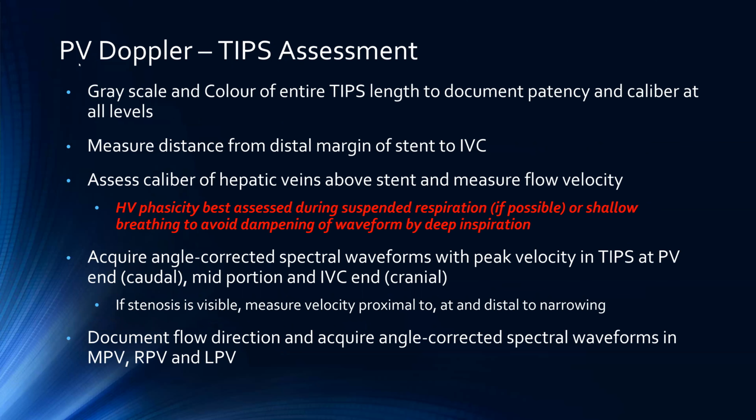So just to quickly go over that portal venous Doppler examination, but more specifically towards TIPS assessments. There is a section within the portal vein Doppler SOP that discusses the assessment of a TIPS.